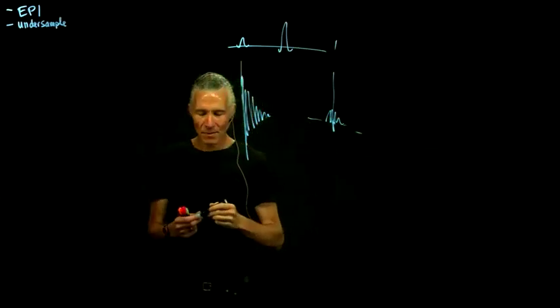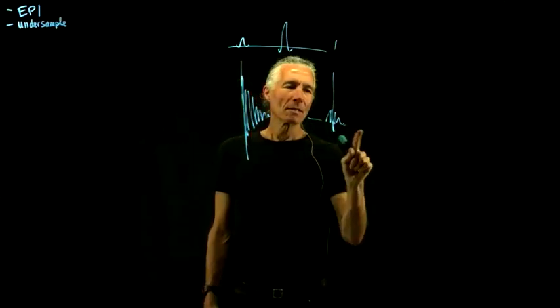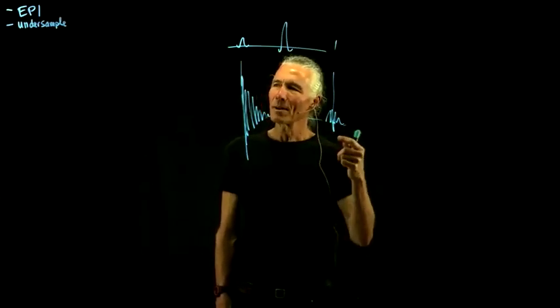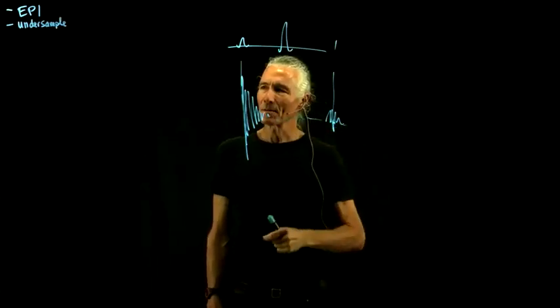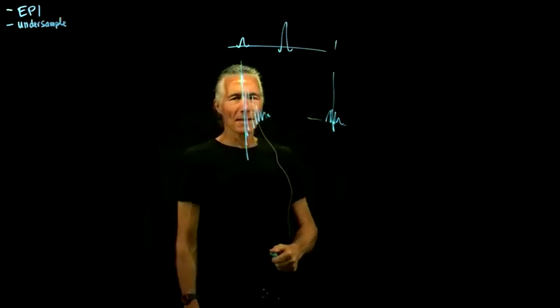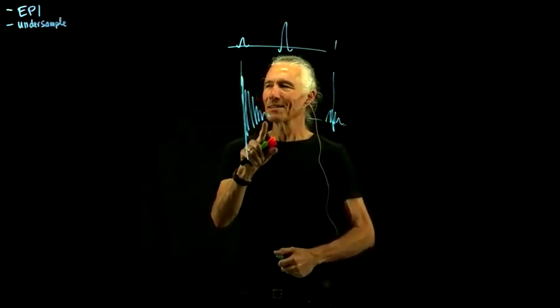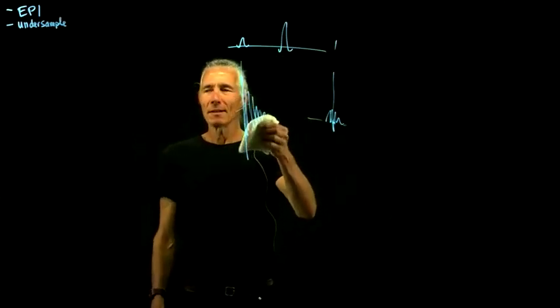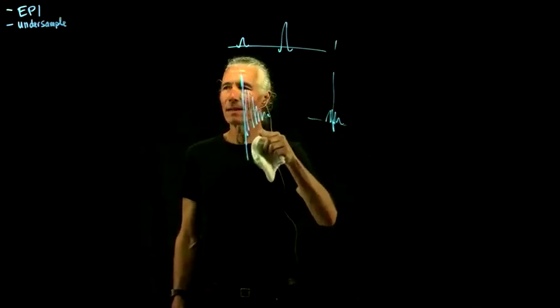So in slow spin echo or slow gradient echo, you just record one echo. And then you have the idea of echo trains. You could do multiple 180s or multiple gradient echoes, but it's still not fully taking advantage of all this good signal. What Echo-Planar Imaging is, is very simple: let's just record all of the echoes that we need for a whole slice from one FID.